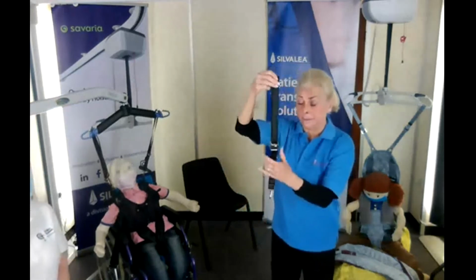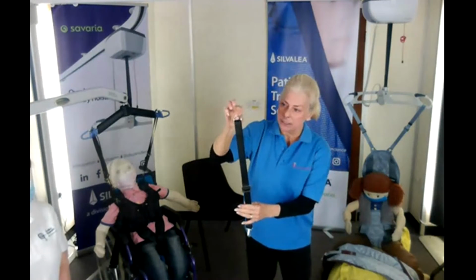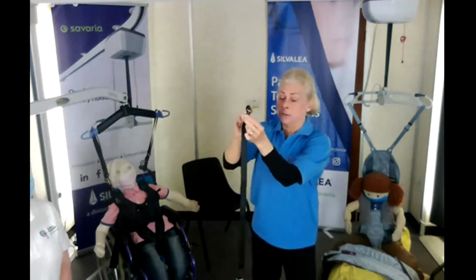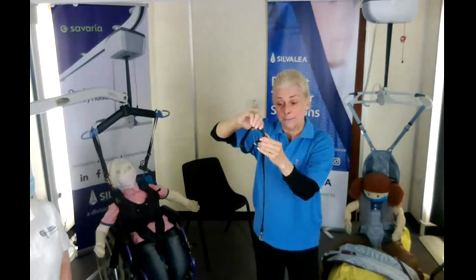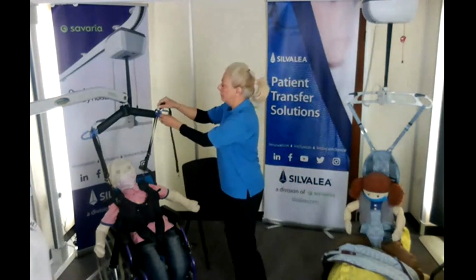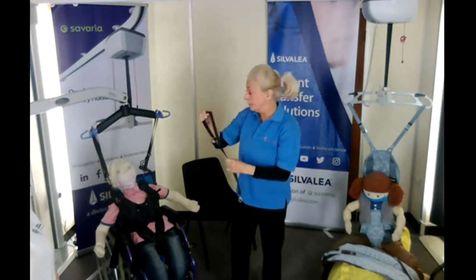So this is the tape. It has got a D-ring. We're trying to get rid of these D-rings, so you might start to see something else on them, a little plastic strip. Basically, a D-ring is there so that if we do extend this tape fully, because we need the extra length, we don't lose that loop. So it's very difficult to get that loop open. So we have a little D-ring to keep the loop. But once you've got your setting, just push the D-ring out the way. If it does get hooked up, it's fine. It's got strength that will, if it goes on the spreader bar and people hook it up, then that's absolutely fine. But generally, it's just to push it down out of the way and then create your loop there.